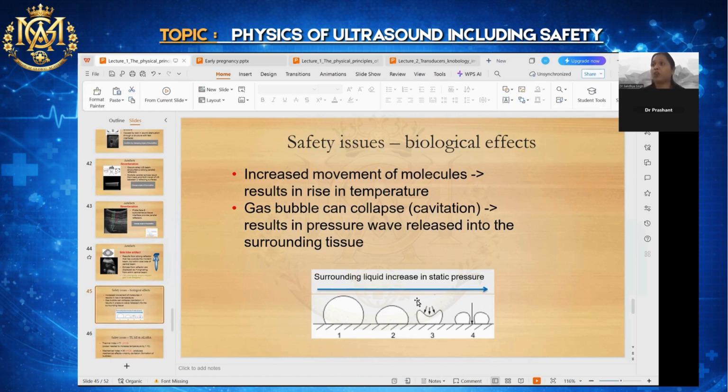Why? Because if the baby is, in particular for me, both are prone, I'm not able to see the face and the heart. I have told them to wait, lie down, eat, walk. When the baby comes in position, I'll do it. Why will I keep the probe and keep transmitting energy when I know the baby will take time to change the position? So we should avoid that.